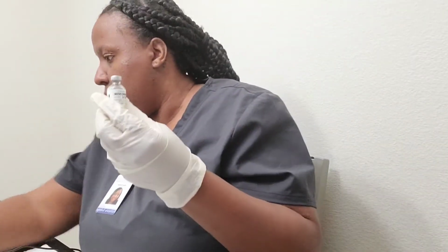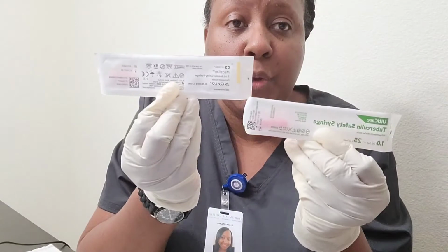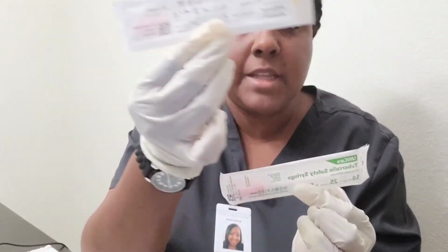I would like to note that in my package, I only got the 2 insulins. I have the 2 insulins, and then I have this practice demo dose, and then I only got these 2 syringes in my package. I didn't get any other. This is an insulin syringe, a tuberculin syringe.